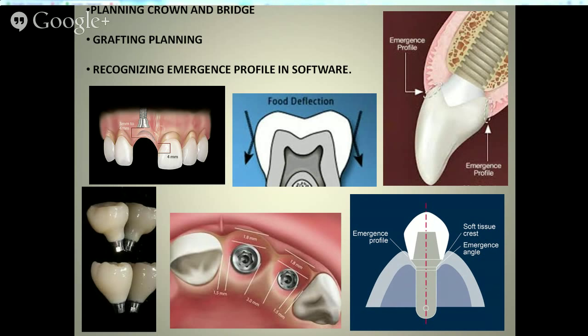papillas. Now, some cases that we work on do not have the possibility of papillas as they're presented to us. However, if enough bone exists, we have the potential to create a situation where we can develop some kind of a papilla by countersinking implants if we have enough room, and working with the restoration in that manner.